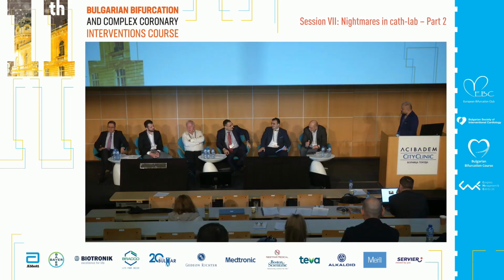Literally, we chased the stent distally, circumflex, proximal, the stent moved, and finally I succeeded to catch the stent, remove it and restent the artery. But usually what happens is that you cut with your wire, because it is very strong, and with the thin strut stents which we use now, it is even easier to do.